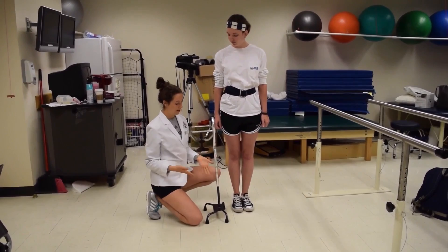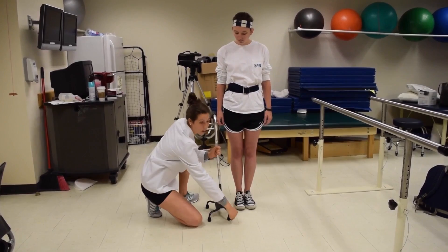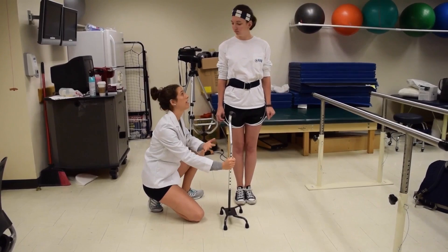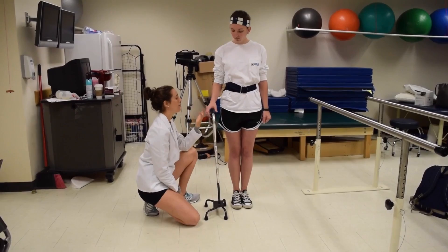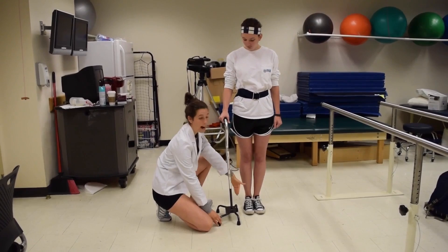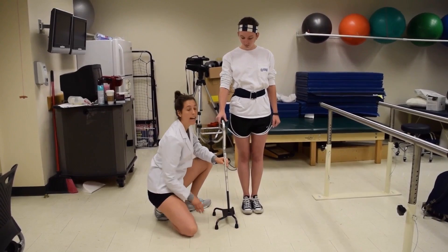There are different canes you can use. We're using a four-legged cane. The biggest thing you want to be sure of is that the flat part of the legs is closest to the side of your patient's body. If this were turned around, as the patient moved it forward it leaves the risk of her tripping over the legs of the cane, which we want to fully avoid. After fitting the height of the cane, we're again looking for that 20 to 25 degrees of elbow flexion. We want to be sure the cane is placed to the side of her outside foot, at least two inches, and four to six inches in front of that foot.